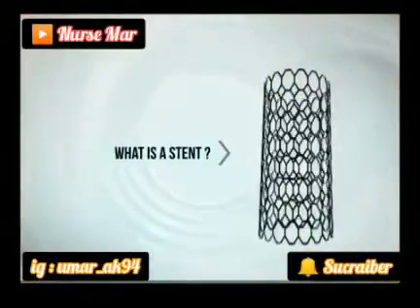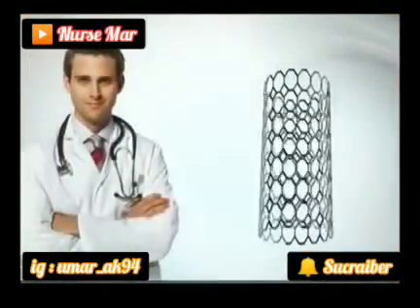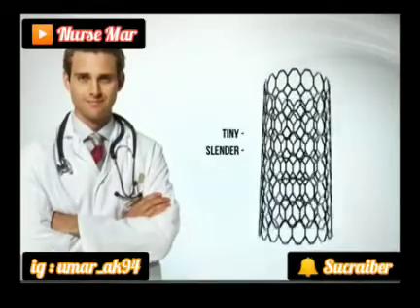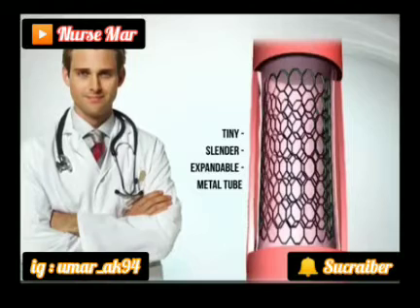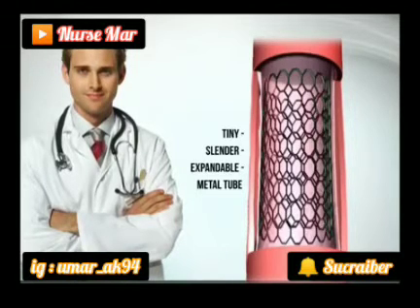What is a stent? A stent is a tiny, slender, expandable metal tube that fits inside a blood vessel once the blood vessel has been widened.